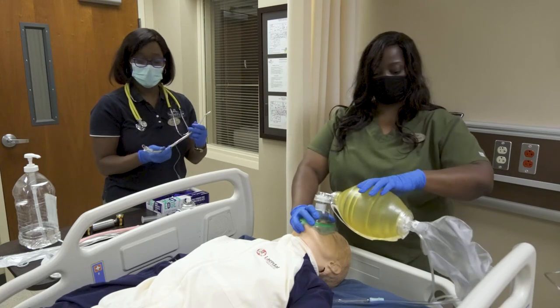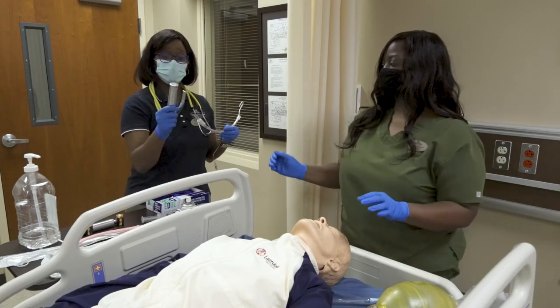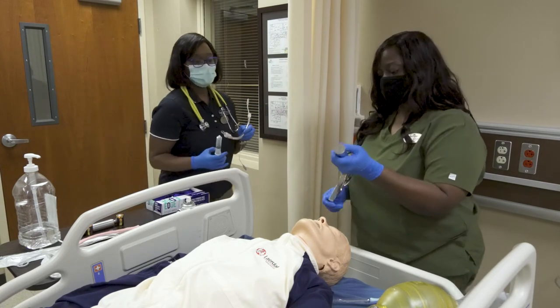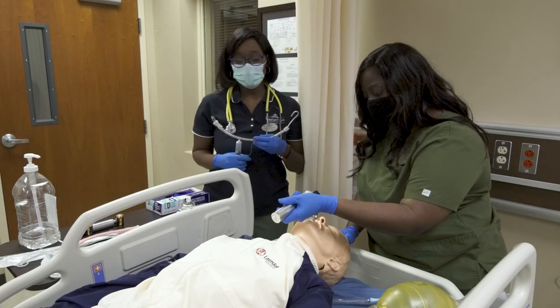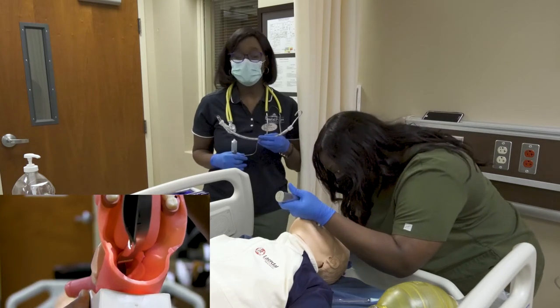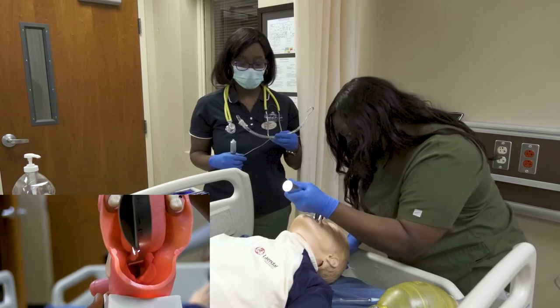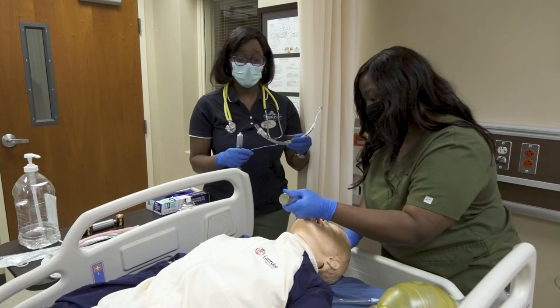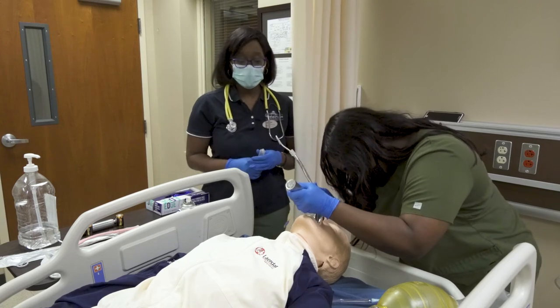Your assistant will be there to assist you in the procedure. Your assistant will hand you the endotracheal tube and will also assist you with the blade during the procedure. You will use your left hand to go into the mouth and visualize the vallecula, making sure you do not lean back on the lip or teeth. When your partner is ready, they will ask for the ET tube, and you as the assistant will provide the ET tube to your partner.